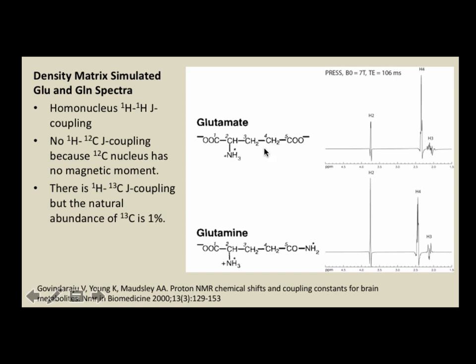You see the protons at each site will have a peak or some signals in the spectrum. You can see the 2 H3 protons have signals around 2.1 ppm. You see all these signals. Then the largest peak comes from the H4 protons. The 2 H4 protons have a peak at 2.35 ppm. This is what we will try to detect.